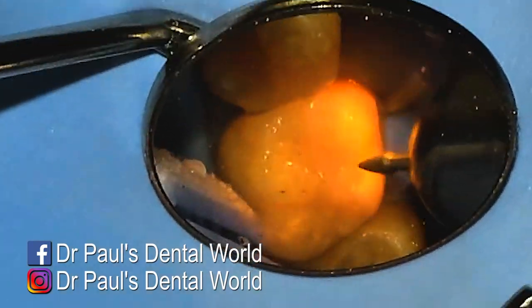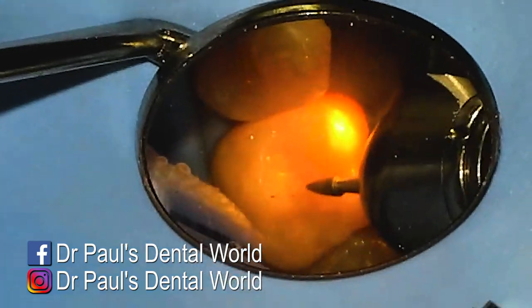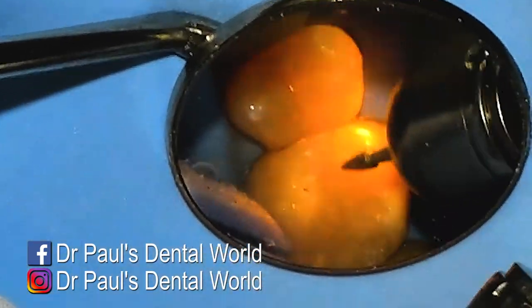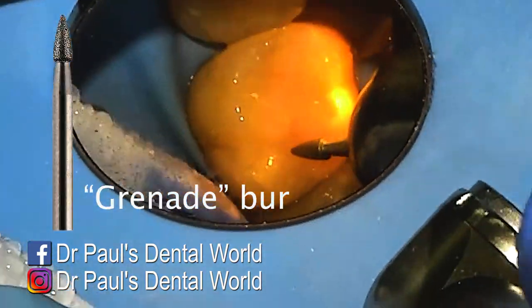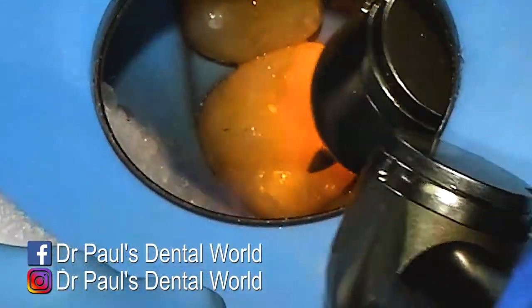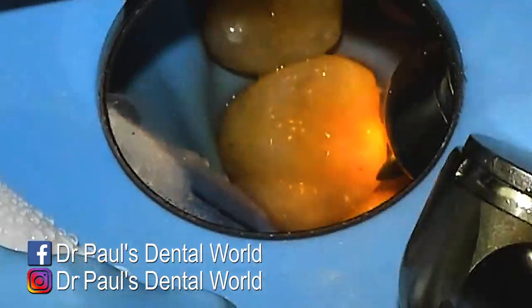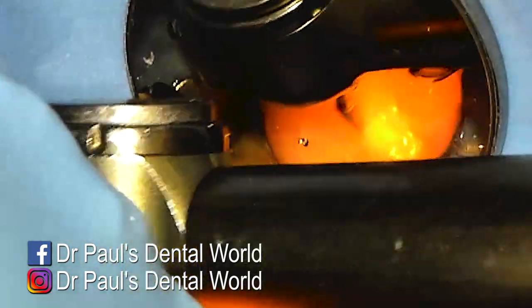Most of my shaping I'll do with burrs. So I'm basically going around now to shape these three fillings to the anatomy of the tooth. I do the shaping mostly at the start with a coarse — it's like a mini Christmas tree burr or a flame burr — and I'll just go around to follow the tooth anatomy just to get the same contours.